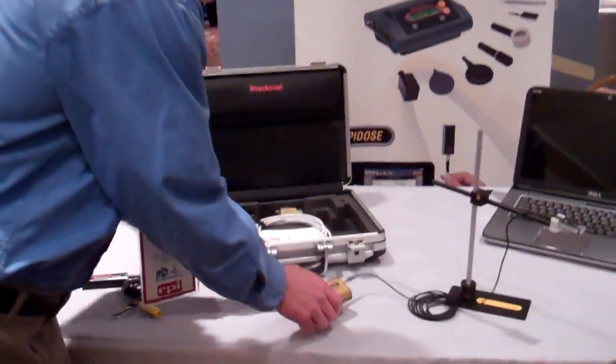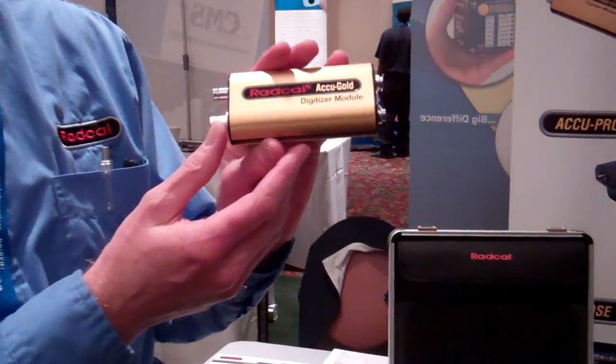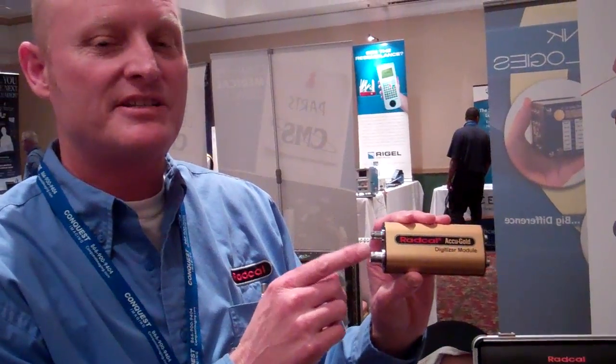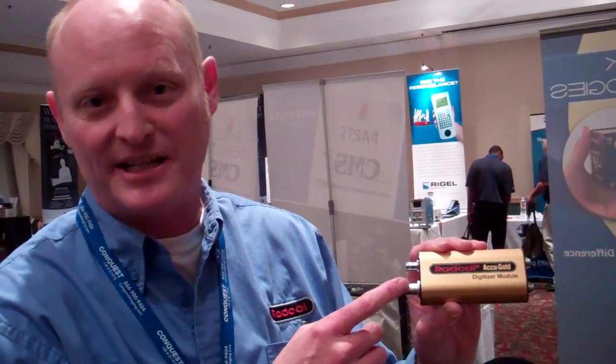It does all that in one exposure. It plugs directly into a laptop, so all your readings dump right into your laptop, including those waveforms. What we also have here today is our very new system called our AccuGold, which uses the same solid-state multi-sensor — you can also plug ion chambers into it, like a CT chamber or an MA sensor, which we have a non-invasive and an invasive MA clamp-lock sensor.